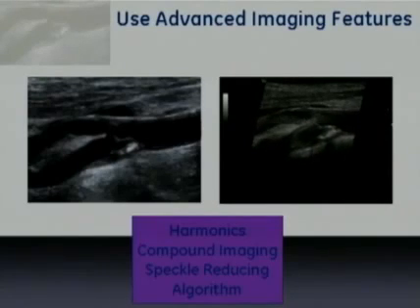So the image on the right that you see is not some new flow imaging technology. That's simply high-frequency harmonic imaging. And it was achieved by using the highest frequency that would actually penetrate, going into harmonics. I steered the beam just towards the direction, or into the direction, of the flow, and then increased the gain within the vessel and decreased my frame averaging.